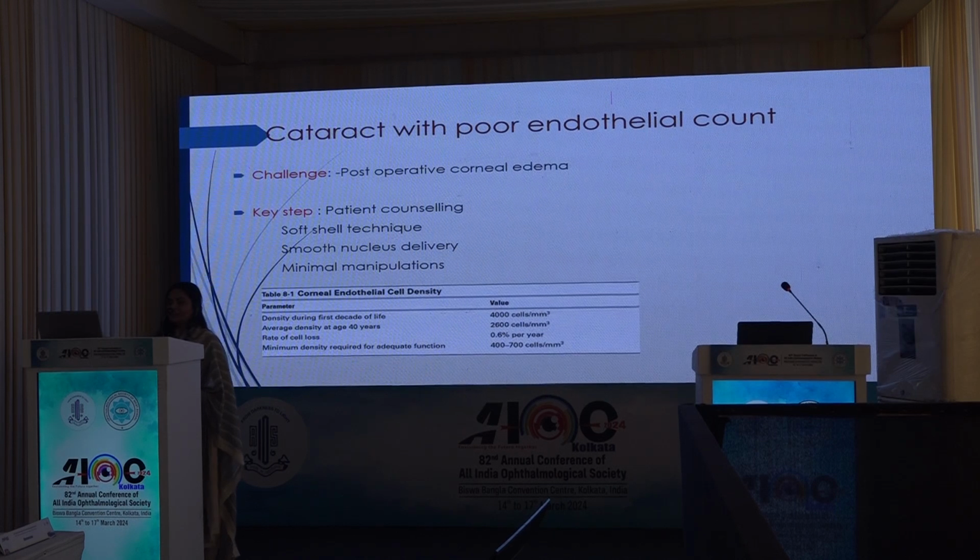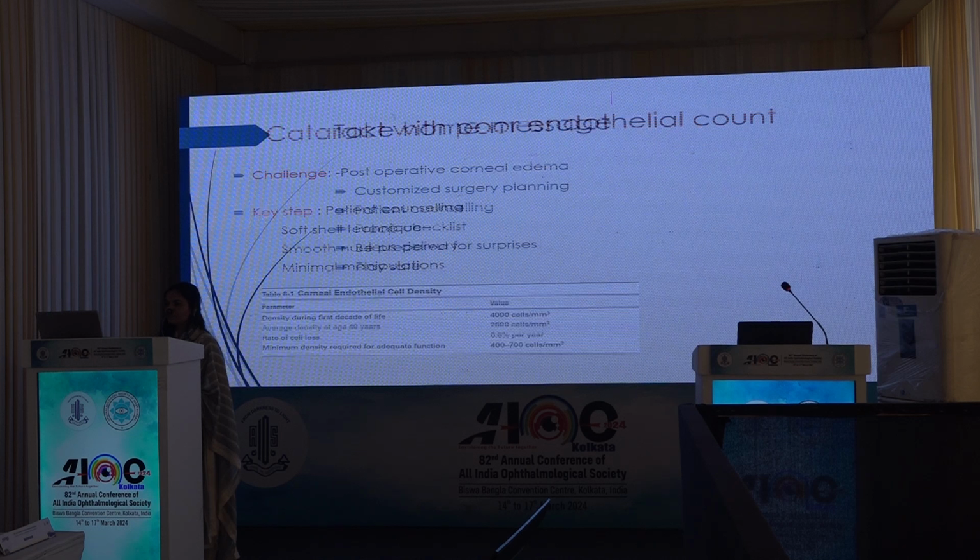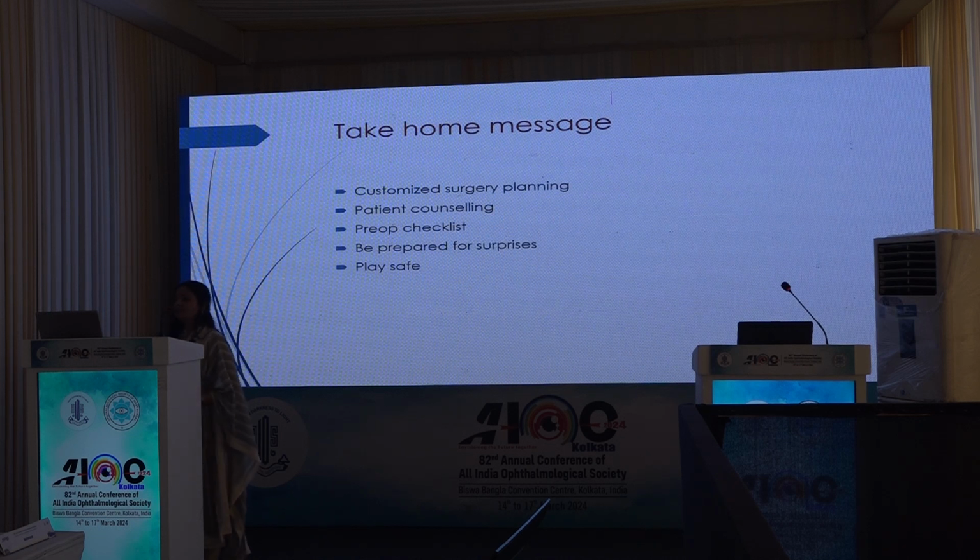The key step is patient counseling, then soft shell techniques should be used, smooth nucleus delivery should be taken into account, and minimal manipulation should be done to reduce corneal edema after surgery. Now my take-home message is customized surgical planning. We should counsel the patient beforehand. We should always check the pre-op checklist, prepare for the surprises, and be safe.